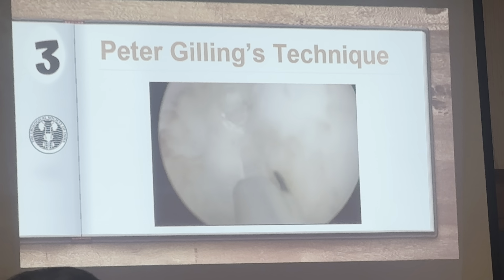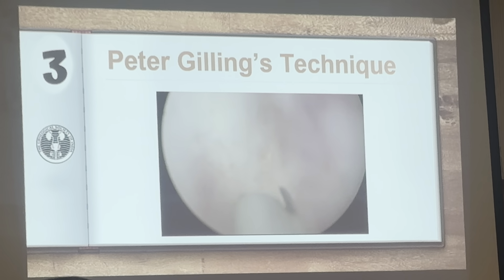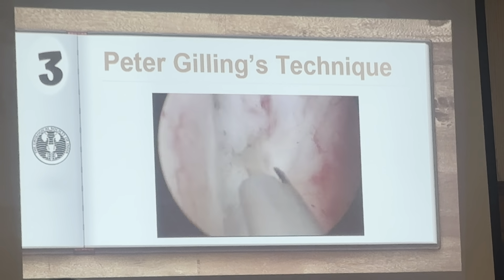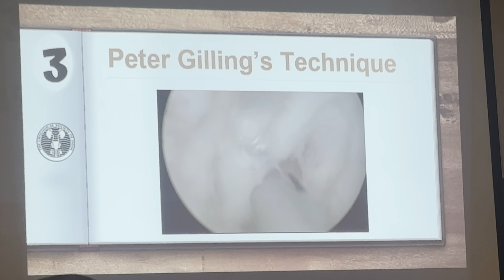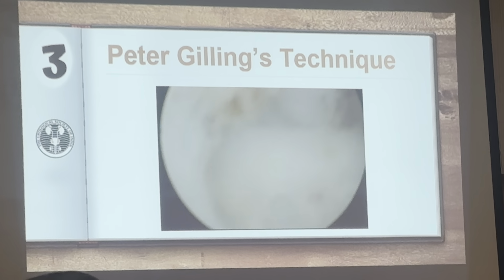So what I am doing is an incision at 5 o'clock and 7 o'clock on the left side and the right side. So that way I am mushrooming, or compressing, the median lobe from both sides. So I am doing it here. I'm working on the left side, and here I am now using that sweeping motion. So I am compressing that median lobe from right to left and left to right.